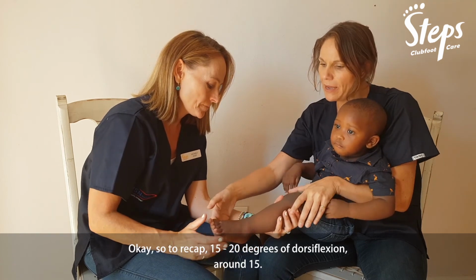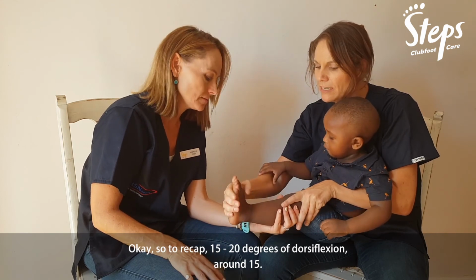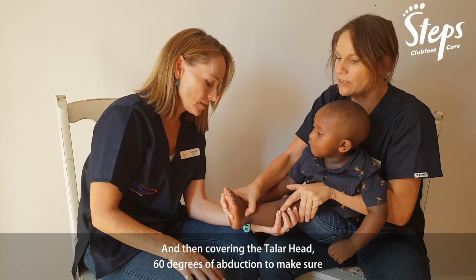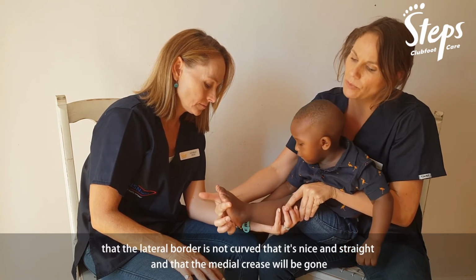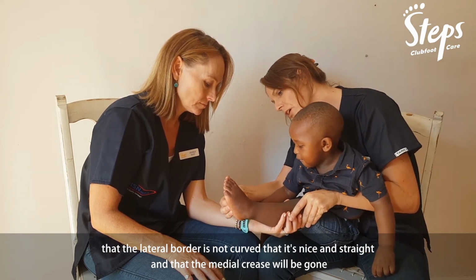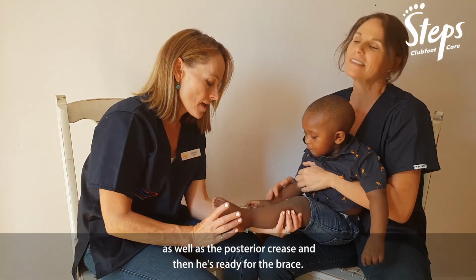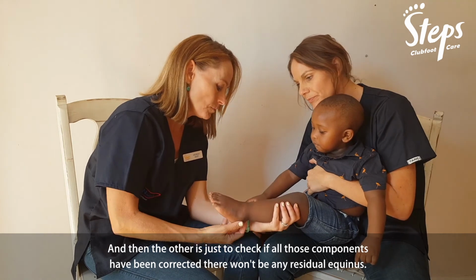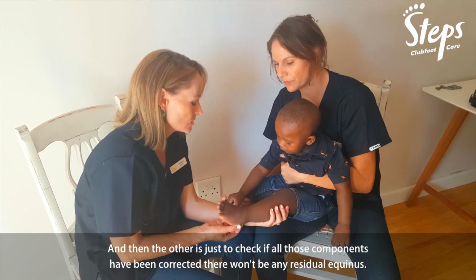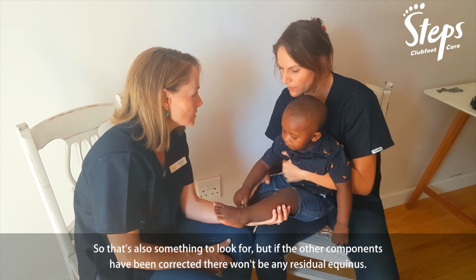Okay, so to recap, 15 to 20 degrees of dorsiflexion. Around 15. Around 15. And then covering the talar head, 60 degrees with the abduction. Correct. To make sure that the lateral border is not curved, it's nice and straight, and that the medial crease will be gone, as well as the posterior crease. Correct. And then it's ready for the brace. And then the other is just to check that if all those components have been corrected, there won't be any residual equinus. So that's also something to look for.